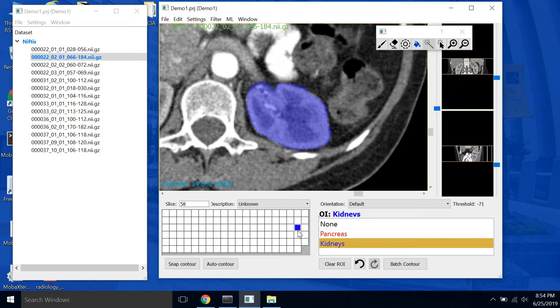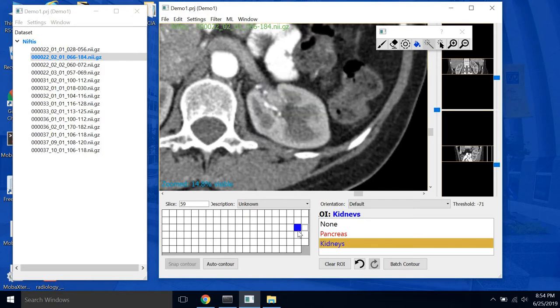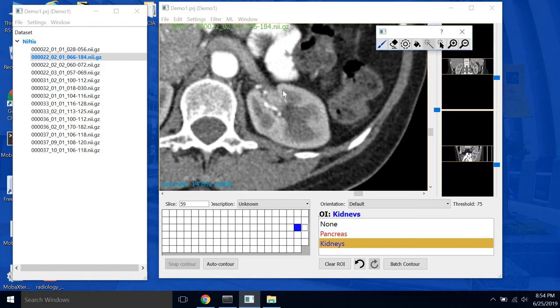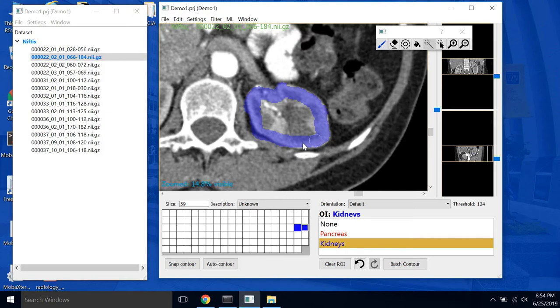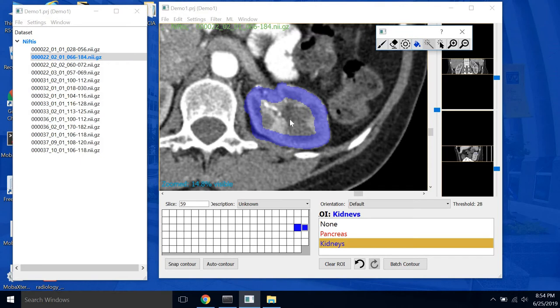So if we use the right arrow key to select the next slice, go back to the paintbrush. Pretty easy to paint around this slice as well. And you can do some touch-ups. I'll show some advanced tools like thresholding and things like that in a future video. But this is just to get you started. And we'll click fill.